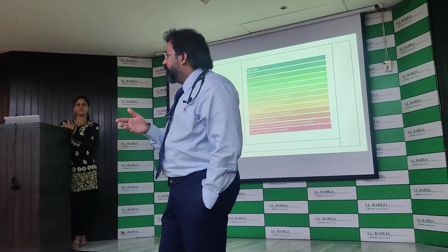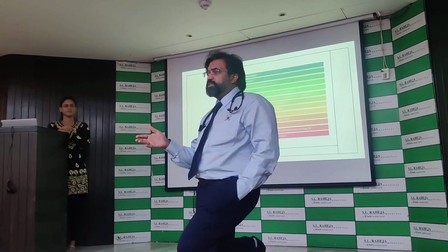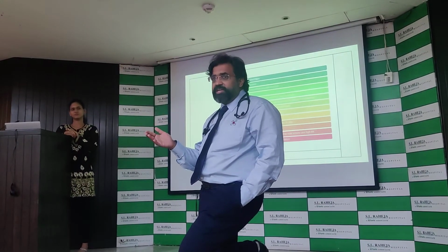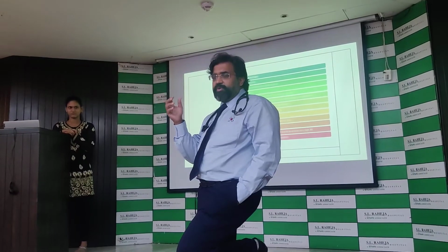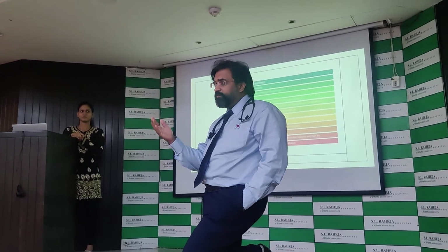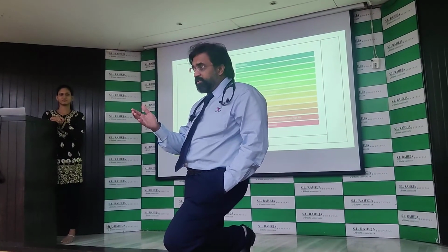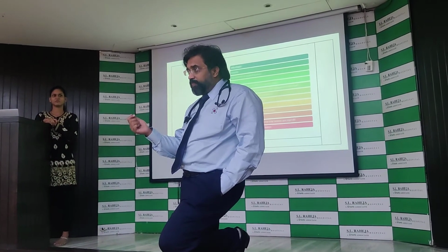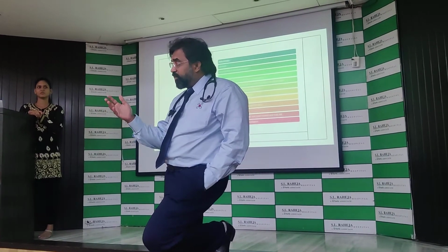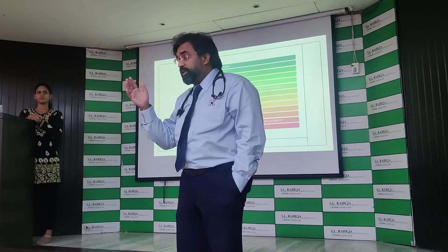The cause may have been that the patient went into a restrictive pattern, fluid has increased, something like that. So it goes into a fast RR to reduce the tidal volumes. Compliance has worsened. That is what occurred. The patient probably collapsed because he was on the ventilator, and compliance worsened. That's why he became fast. Why did he become fast? Because we had extubated him. After extubation, what is going to happen? His PEEP is gone. So there has been a collapse in the lung, and that collapse has caused the compliance to reduce.